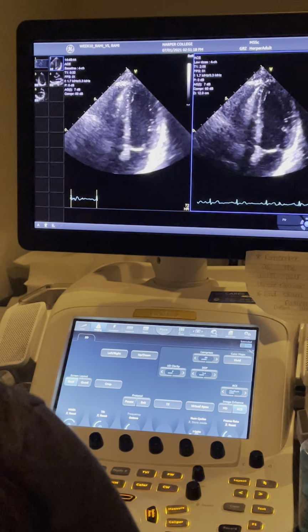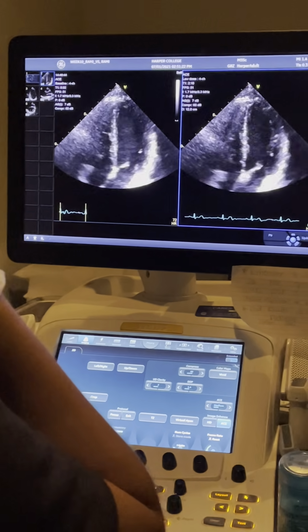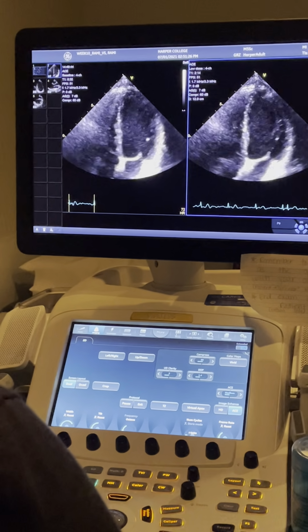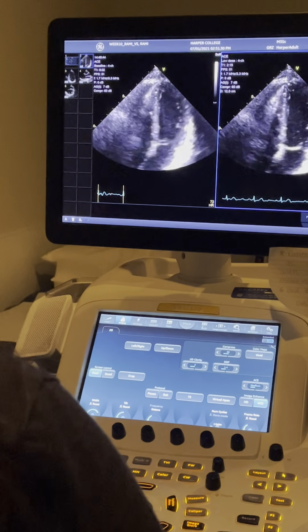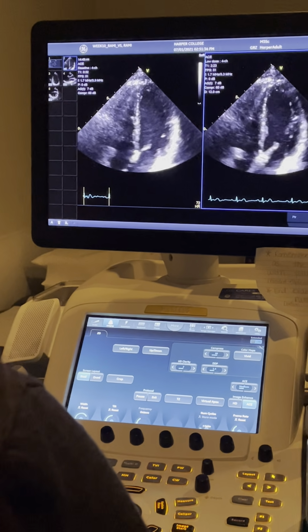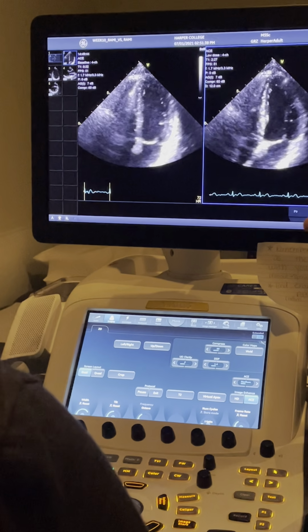You have a little bit of time when they're doing a dobutamine because they're not coming off a treadmill, and you have 60 seconds. They've got medication keeping their heart rate up, but your patients will feel terrible. Their heart's racing, they're laying flat, they normally get headaches, they get nauseous, some actually even throw up. So you do still have that urgency of trying to move as quickly as you can, but you have a little bit of a cushion where you don't have that with someone that's on a treadmill.